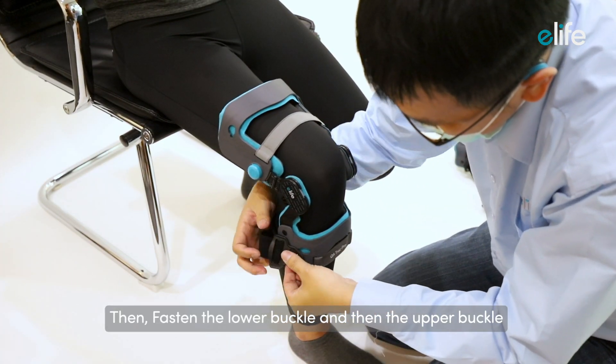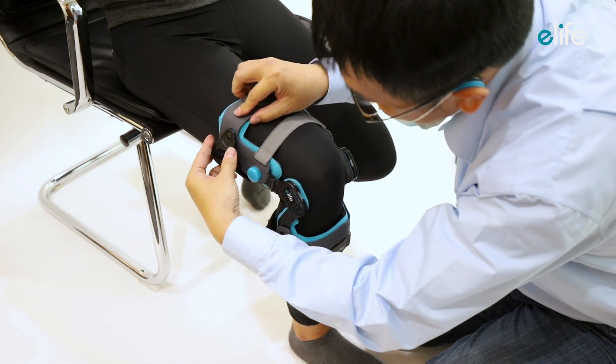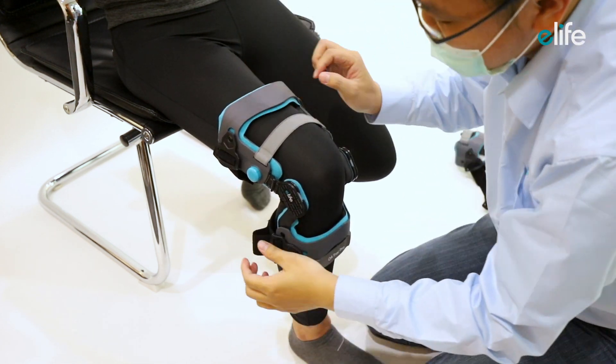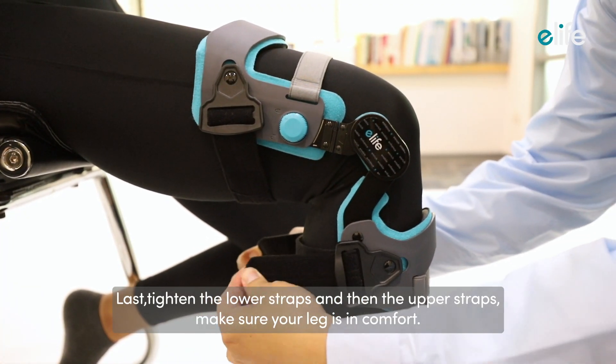Then, fasten the lower buckle and then the upper buckle. Last, tighten the lower straps and then the upper straps.